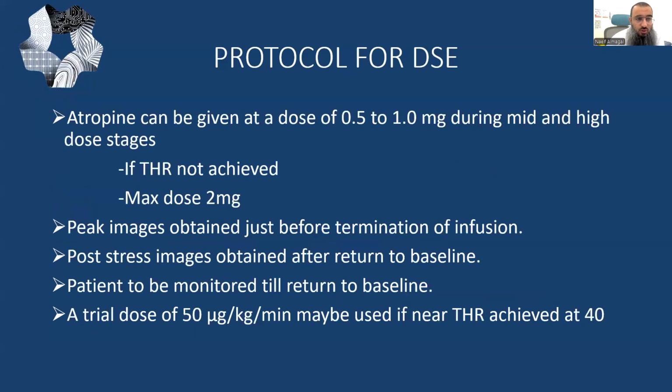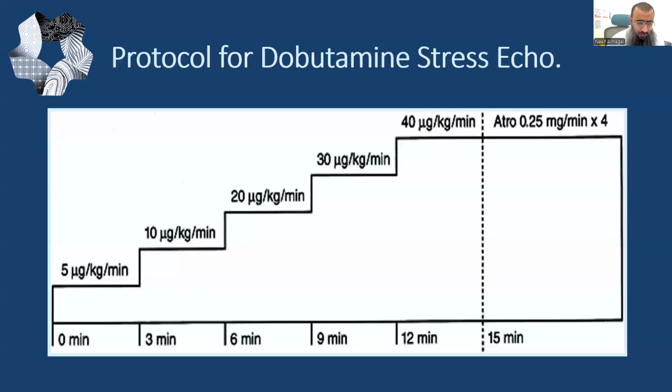Atropine sometimes can be used as an augmentation if we didn't achieve the target heart rate. And getting the recovery image is very, very important after the return to the baseline, and keep monitoring your patient.